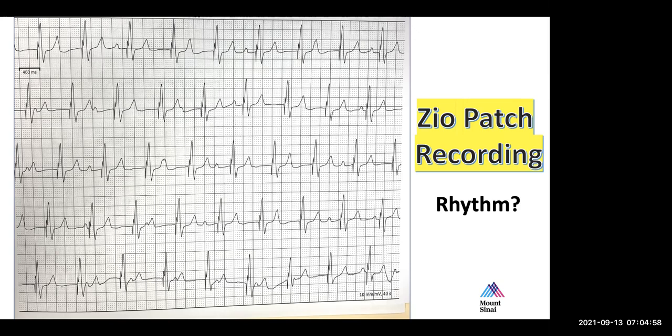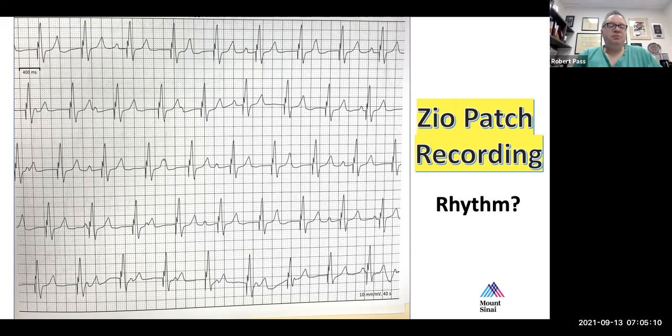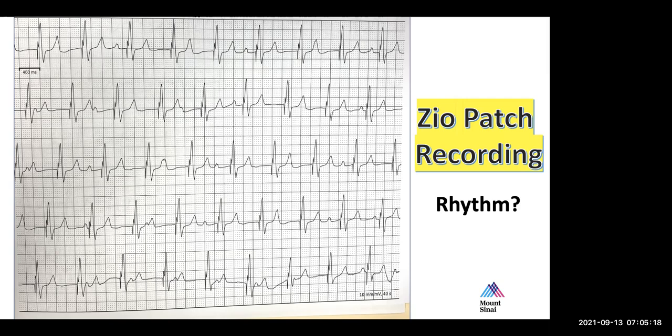So what precedes it is the atrial depolarization. So, right, P wave, right? Yeah. And what immediately follows the delta wave? It's the ventricular depolarization.